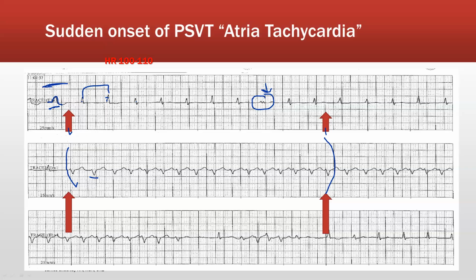So what we mean when we say that it's flipping up down, we're just describing that QRS complex. The first line is pointed towards the ceiling, and then when it flips over, it's pointing to the floor. These are any number of issues, but they're more in-depth issues. So we're talking about aberrant conduction systems. We're talking about re-entry tachycardias.